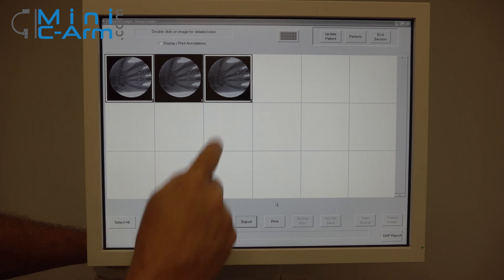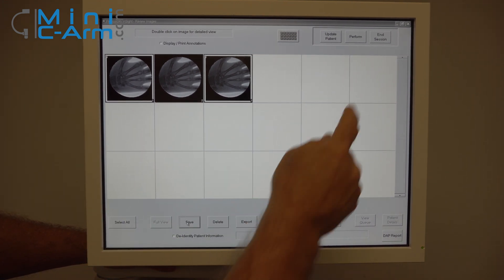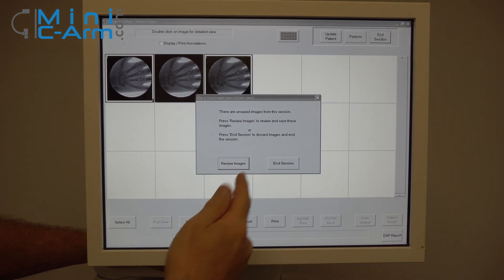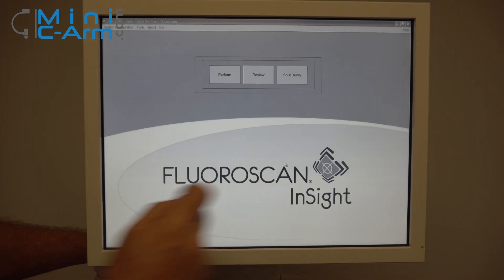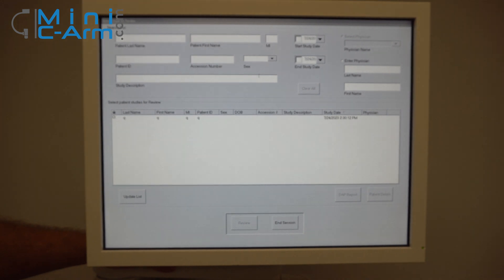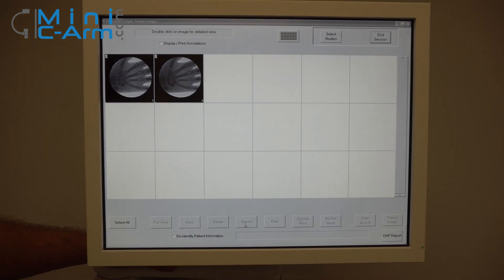You can also save images permanently to the system. We're going to save these. When you're finished, just press End Session. It's going to give you a pop-up — if you've already saved the ones you wanted, go ahead and end session. To confirm they're there, here's your case: select it, press Review, and there are your saved images.